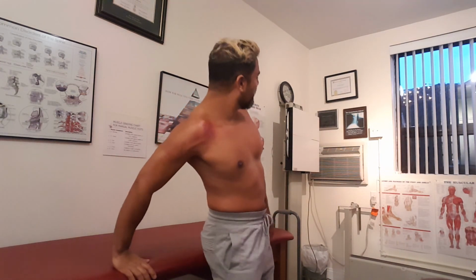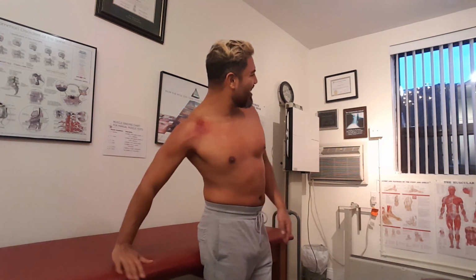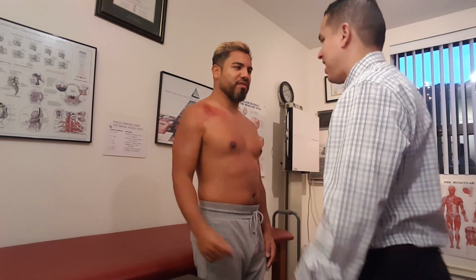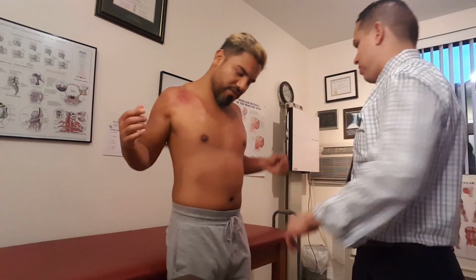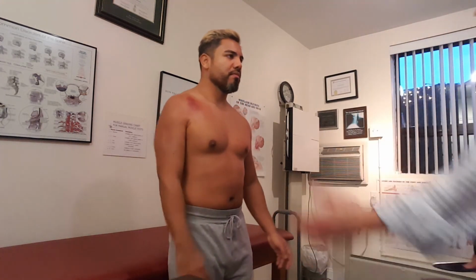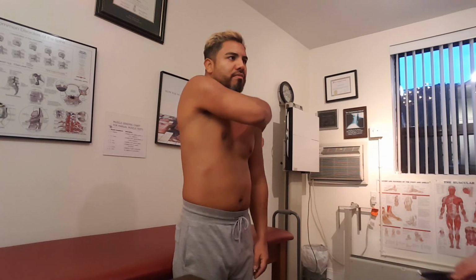Am I supposed to feel like that? Listen, I just worked you pretty hard. Oh my god, yeah. Okay. All right. But it's supposed to be temporary. Now, just kind of stretch it out for a moment. So I relax. Okay. All right, and just bring it in, and let's see how your range is.